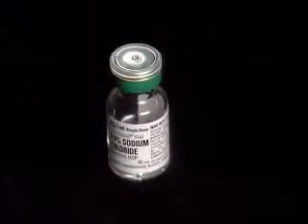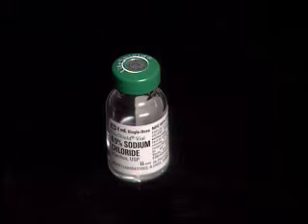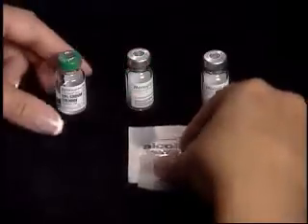Open the Q-cap by peeling back the label and set aside. Remove the plastic cap from only one vial of diluent, regardless of how many powdered medications are prescribed. Clean the rubber stoppers of all vials with an alcohol wipe.